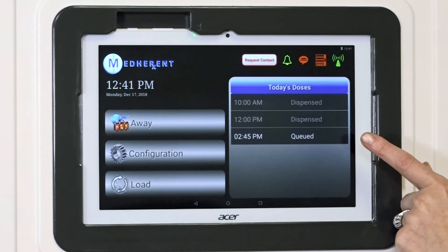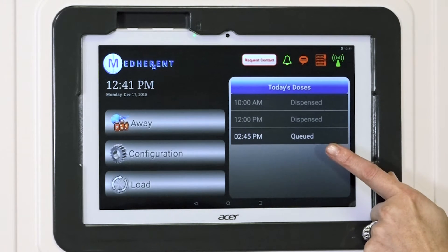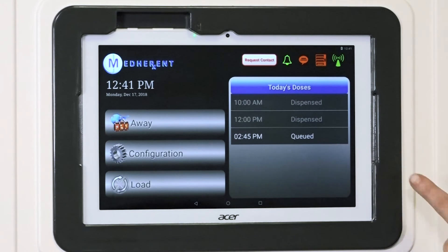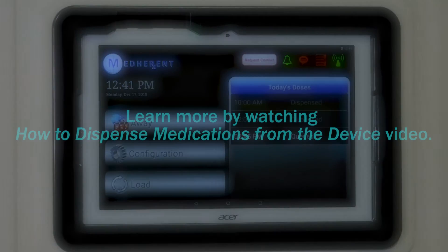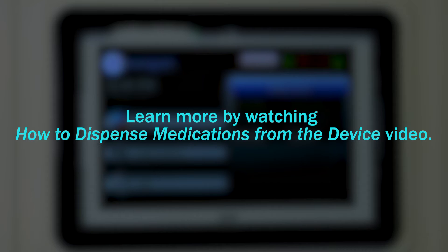On the right of the screen, you'll see a section labeled 'Today's Doses,' which serves as the heart of the Medherent system. As such, we've created a separate video training module that details what this is all about, called 'How to Dispense Medications from the Device.'